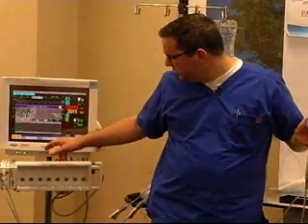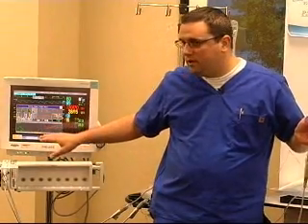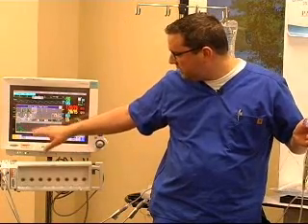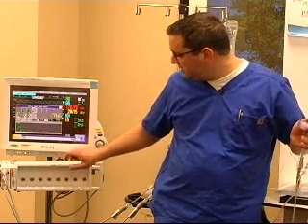So, all right, once this one's calculated in, how do we get rid of the one we don't want? You just tap on it, right? And you'll see that it grays out on the monitor here. And when it's grayed out, that means it's not included in the average, okay?